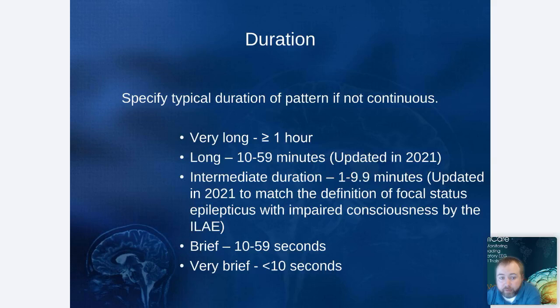Next, you have duration. So specify the typical duration of the pattern if it's not continuous. It could be very long, intermediate duration, brief, or very brief. You can see the intermediate duration they updated in 2021. This was to match the definition of focal status epilepticus.